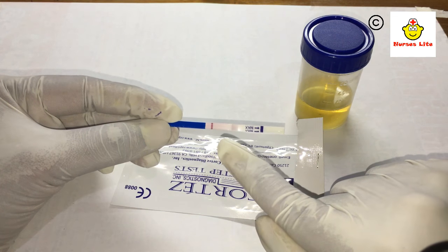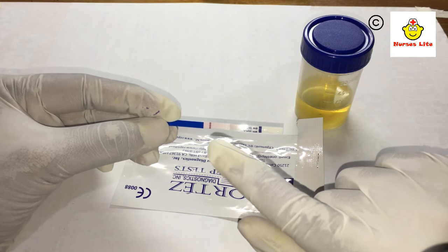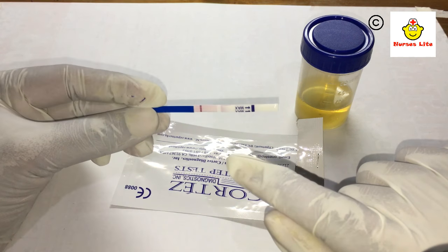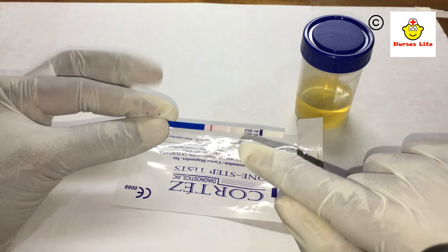If you dip this strip into water, you will also see only the control line and no pregnancy line. If double lines appear, it means you are pregnant — there is no doubt about the pregnancy. Thank you, this is the end of the test and you can try it at home. Wish you all the best.